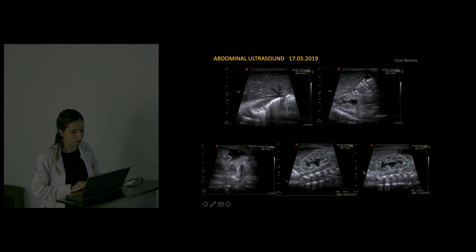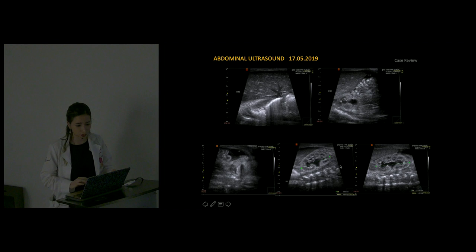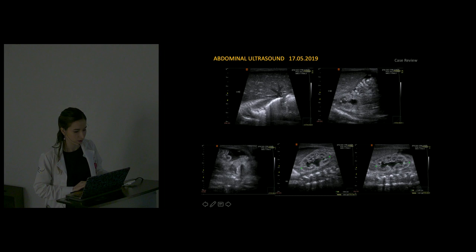We can also see both kidneys, which were of normal size and morphology, but the echogenicity was increased in the parenchyma, with dilatation of the pyelocalyceal space. In this clinical context, we can assume this patient has sepsis or systemic involvement, because we can see involvement of the kidneys with a probable glomerulonephritis, free fluid, and hepatitis. The spleen and liver measurements were normal for the patient's age.